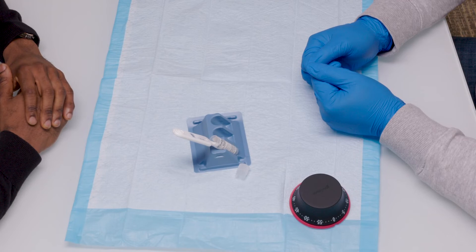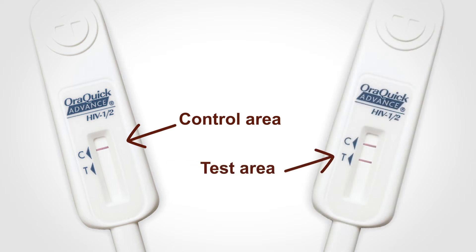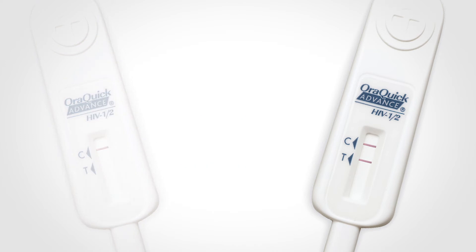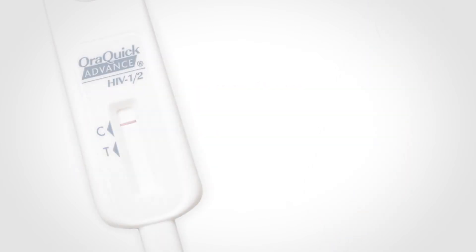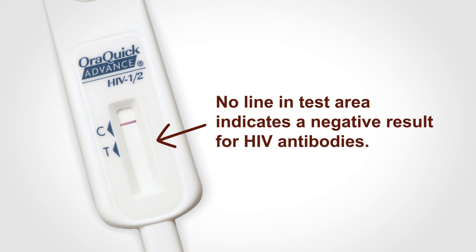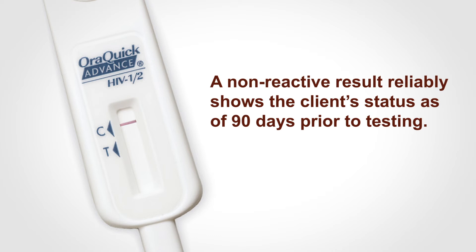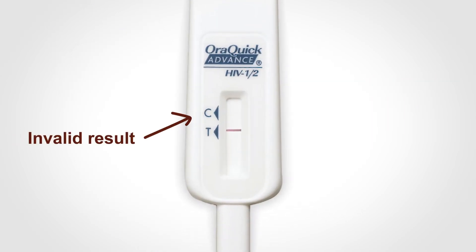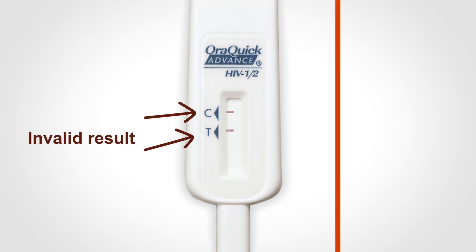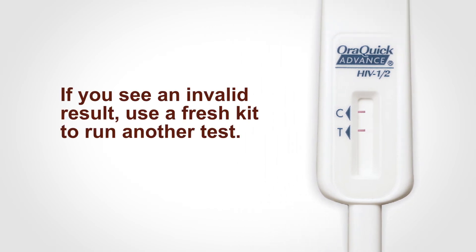After the appropriate time has passed, look for a line in the control area — this shows the test is working correctly. Now look at the test area. A line in the test area indicates a reactive result and is considered to be preliminary positive. A preliminary positive result should be confirmed with a follow-up test. No line in the test area indicates a non-reactive result and is interpreted as negative for HIV antibodies. A non-reactive result reliably shows the client's status as of 90 days prior to testing. A test can be invalid if there isn't a line in the control area, even if you see lines in the test area, or if the lines are not all the way across the strip. If you see an invalid result, use a fresh kit to run another test.